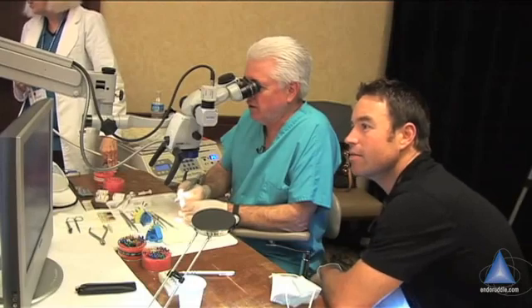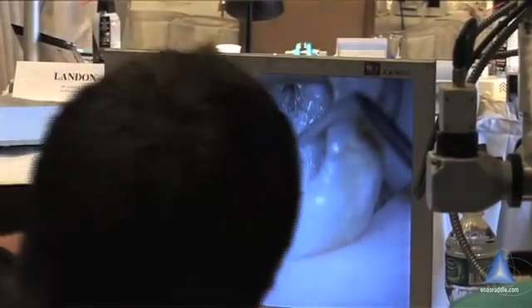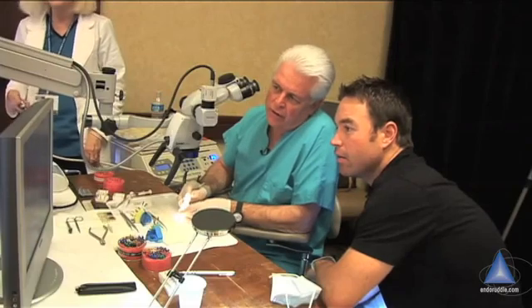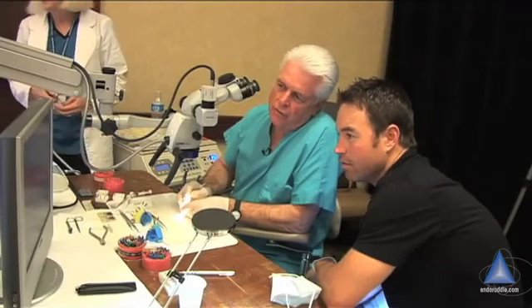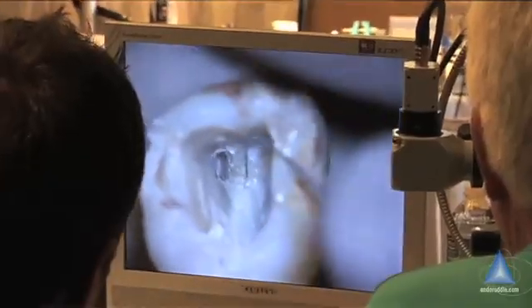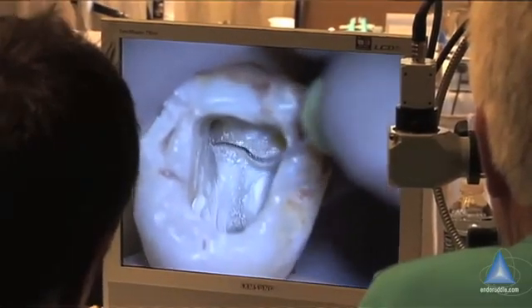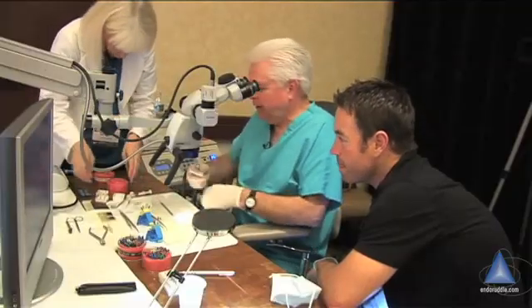Now back to the MB2 that we pretty much think we should find. Do you see this? My question was basically: can I go in here — when I see that line it would make sense. We look at the x-ray and we're not sure, but if you take a mesial film you go, 'God, it's a really broad root.' Broad roots usually have two canals. This groove is what I'm locked onto, and it could be breaking off internally, so I want to explore that.